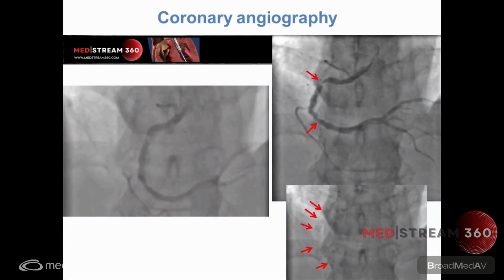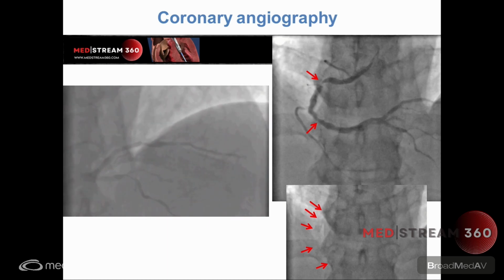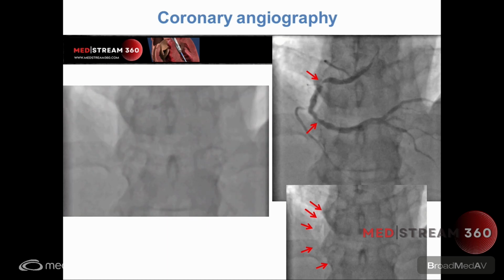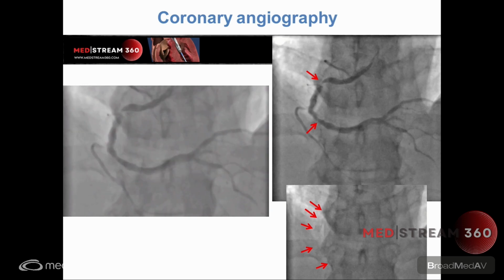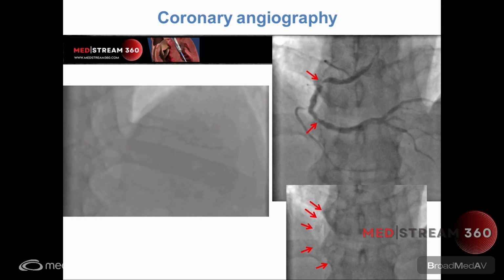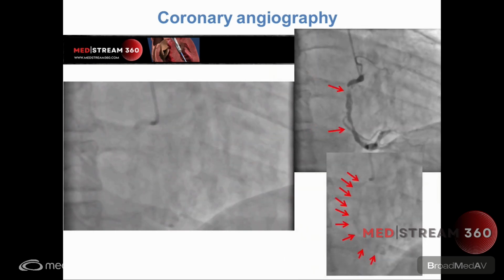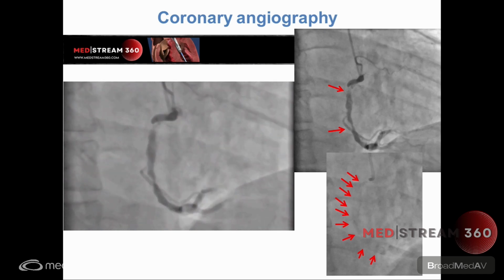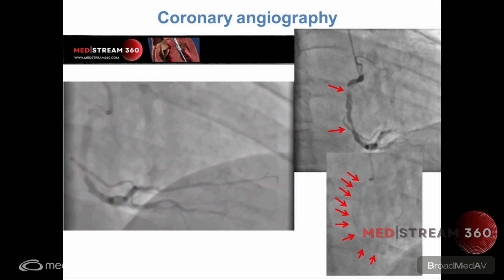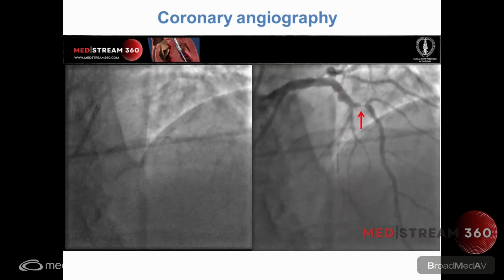And this patient underwent coronary angiography, and as you can see here, he has a tight lesion on the proximal RCA. There's another lesion on the mid to distal segment. We can see also on fluoroscopy that the vessel is calcified. And here in another view, you can appreciate the lesions that this patient presents.